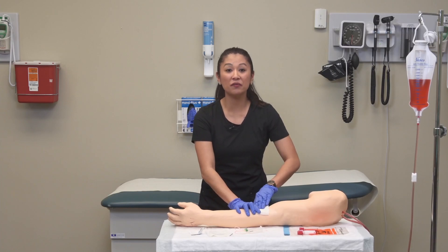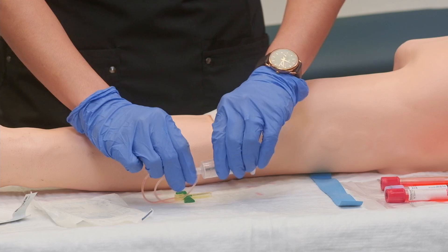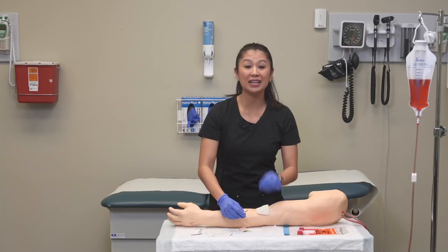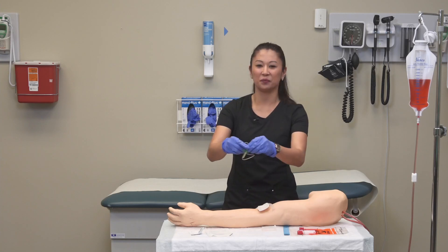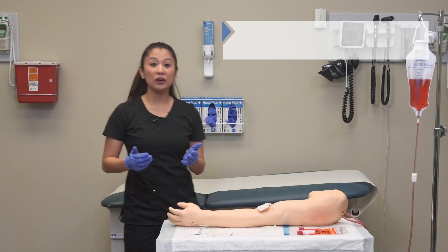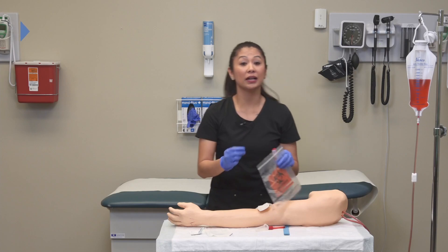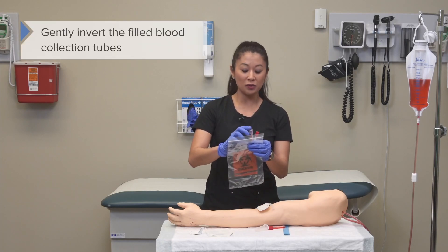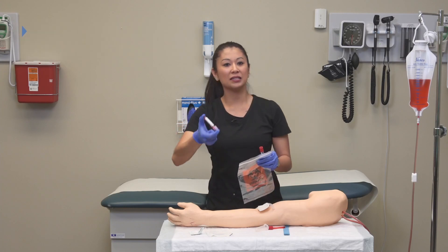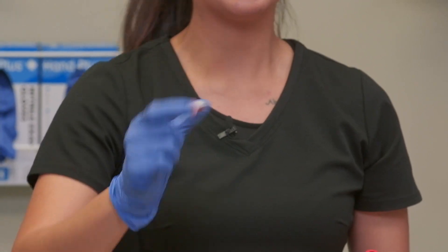Now that we've got the dressing down, take your needle and remove it from the blood collection device, then place it into the sharps container. Once that's done, gently invert your blood collection tubes — we don't want to shake them, just simply invert them to mix the blood with the tube's additives.